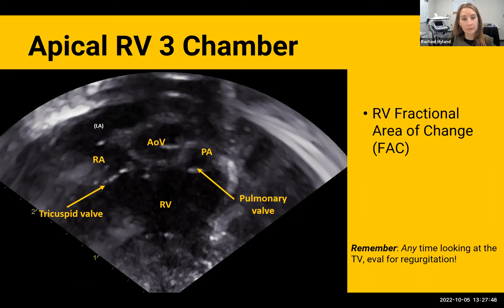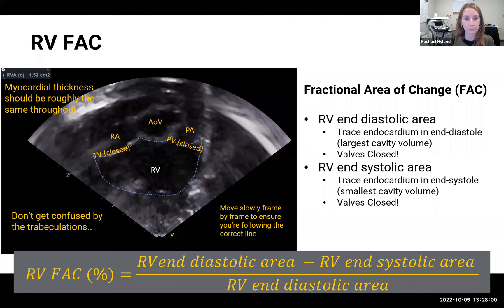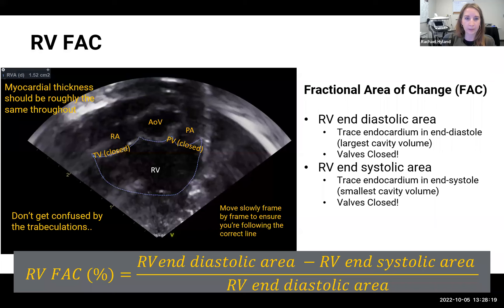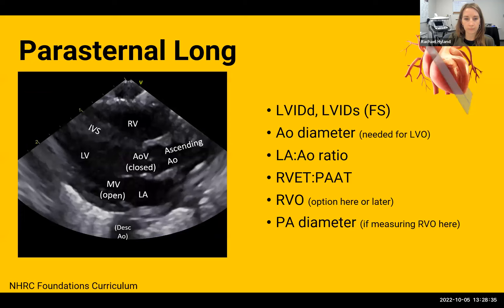Moving into the RV three-chamber view, this is probably a more unique view to hemodynamics but really focuses on and exposes a broad part of the RV. We use this view to obtain RV fractional area of change, one of several measures we use for RV function including TAPSE and RV S-prime. To obtain the FAC, trace the RV cavity tightly at end-diastole and end-systole, similar to what you do for Simpson's biplane. In the RV there can often be trabeculations along the bottom — ignore those and tightly follow the RV border and trace along and around the valve.